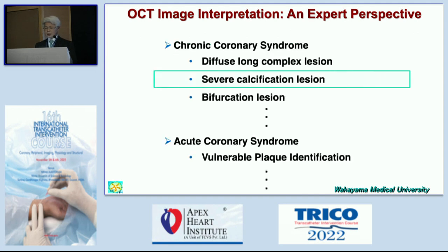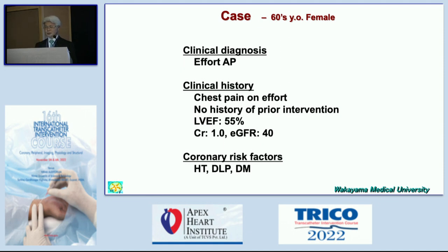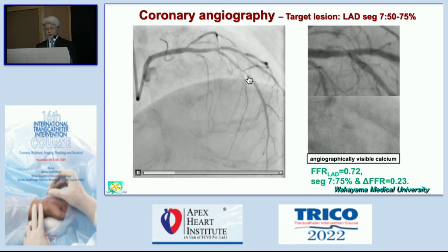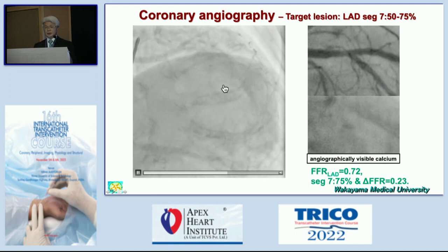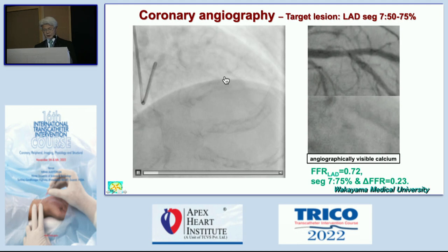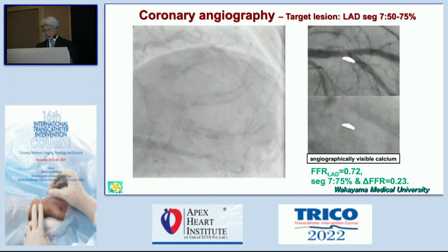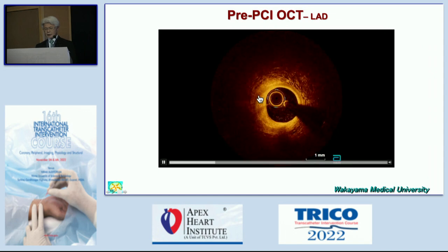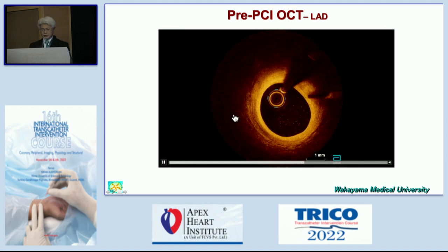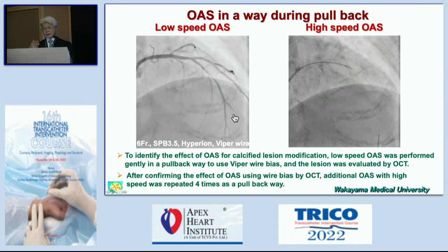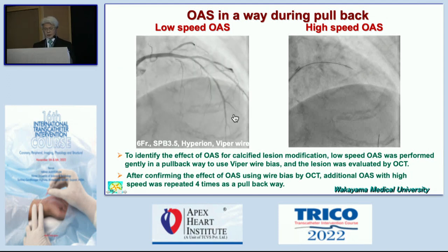Moving to severe calcification: not only multiple calcium but also tiny spotty calcium can become a problem. This is a case of a 60-year-old patient with angina. Angiography shows a relatively simple region — quite easy to put one stent. However, you can identify some calcium deposition at the bifurcation of the diagonal branch here and here. The OCT image from the distal part shows a very eccentric plaque with calcium at the diagonal, positioned on the myocardial side. Therefore, we performed orbital atherectomy and confirmed with OCT afterward.